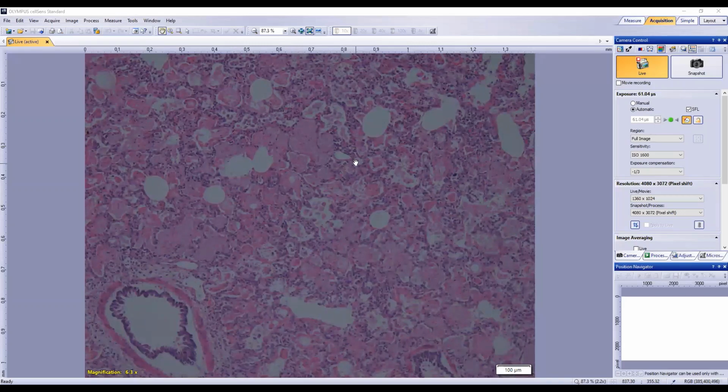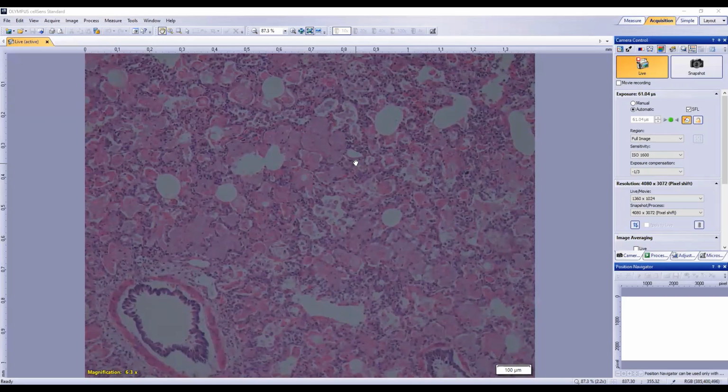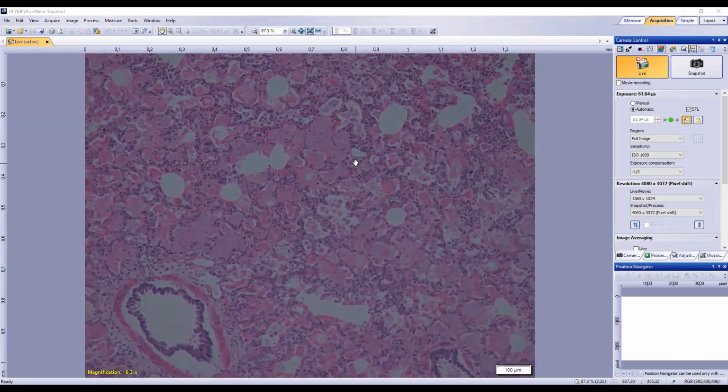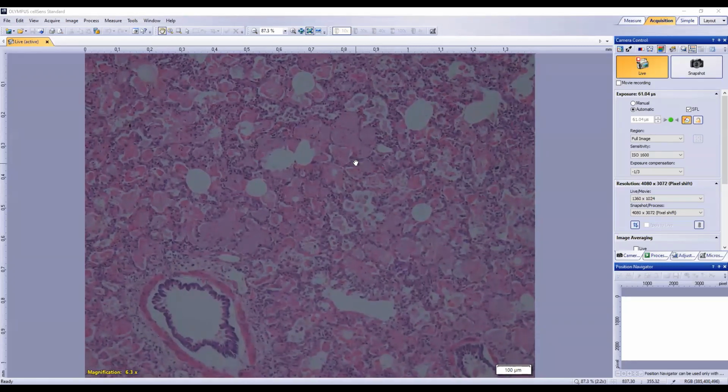So there'll naturally be a mix of those two types, and the appearance of the fibrin is going to depend on how long it's been there, because it's going to polymerize when it mixes with air. So how much is there, how long it's been there, all of that.